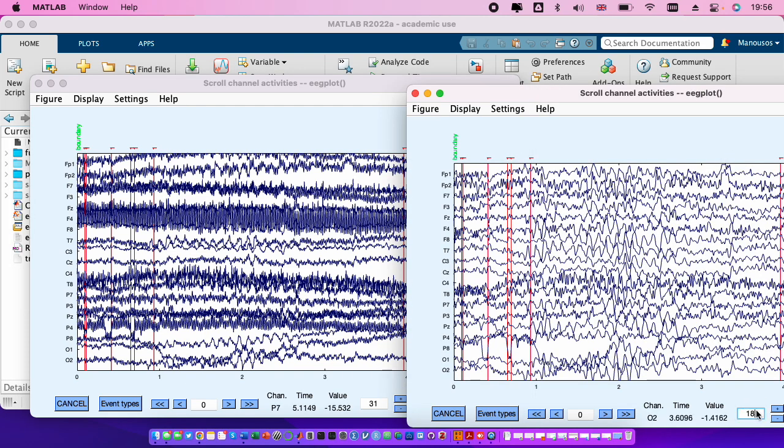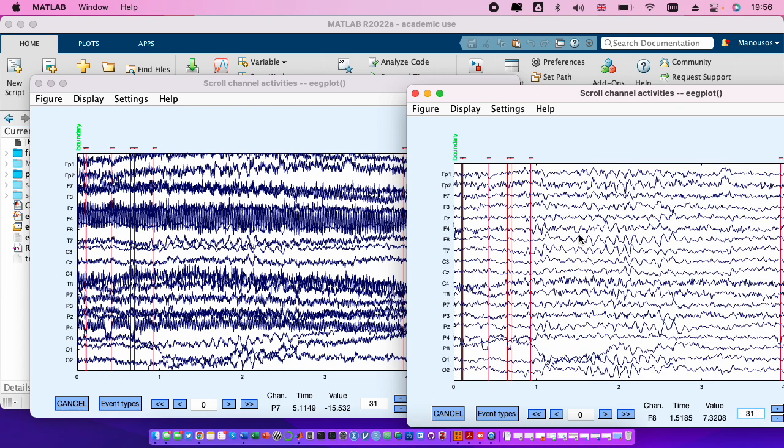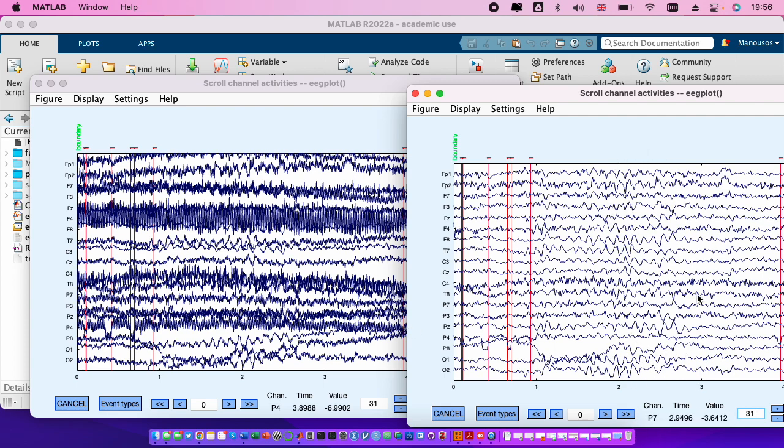And you see how much cleaner they look after the filtering. So let's put them on the same scale, 31. You see that most of the noise was removed and what we see here actually is a very nice alpha wave.